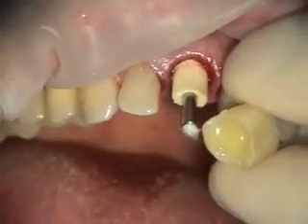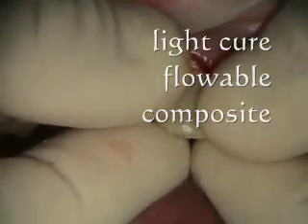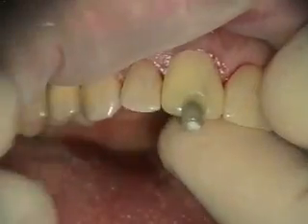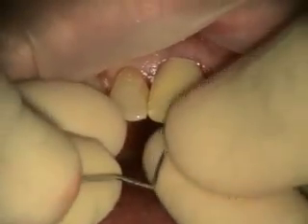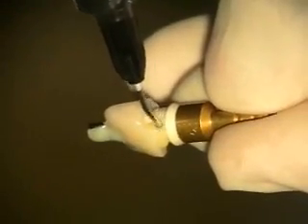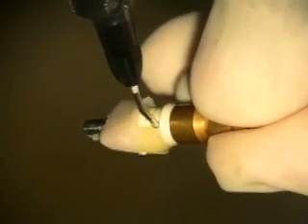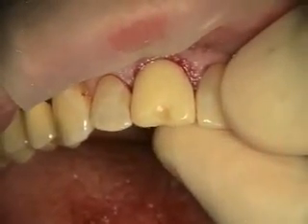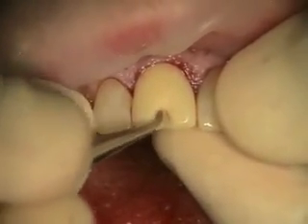It feels like it's almost out — yes, I have another one. I'm just going to backfill it. I'm just going to put some cotton in there. I used to put a perch in there but it's harder to remove.